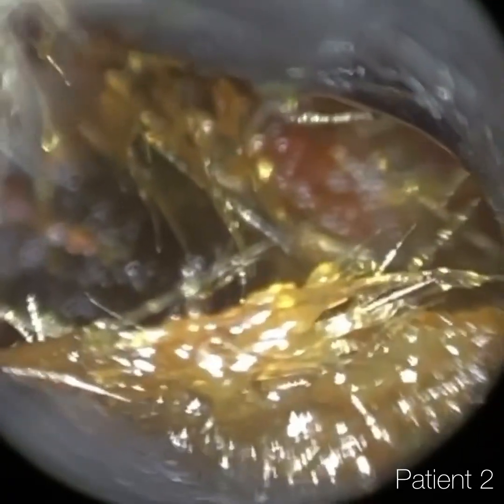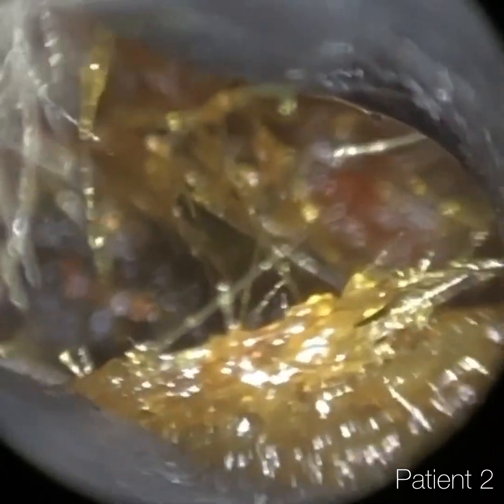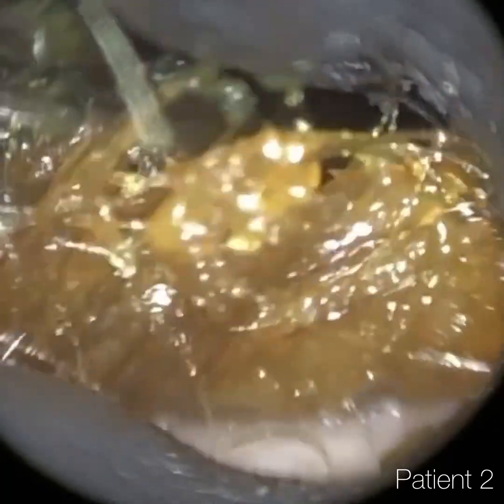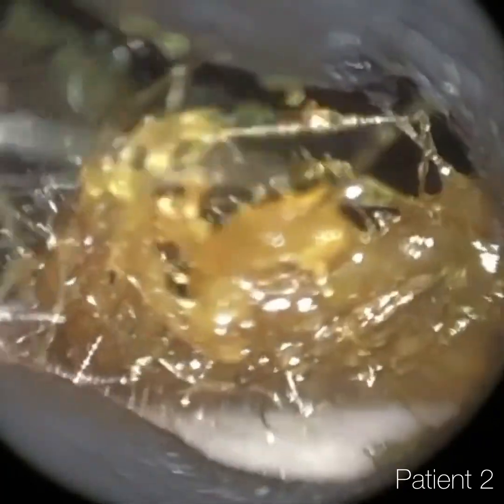And you can see there's loads of hairs that are matted — so that might have given it away now. Patient two, if you hadn't guessed already, is the husband. And patient one is the patient's wife.